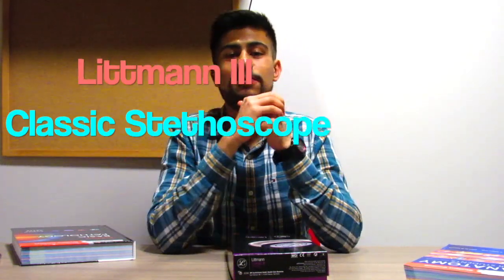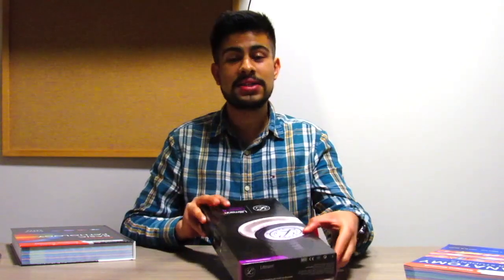In today's video I'm going to be doing an unboxing and a review of the new Lipman Classic 3 stethoscope. I got the stethoscope from this amazing website that's based in the UK.